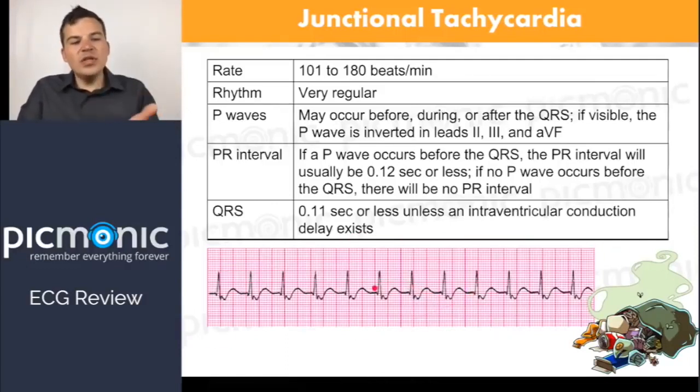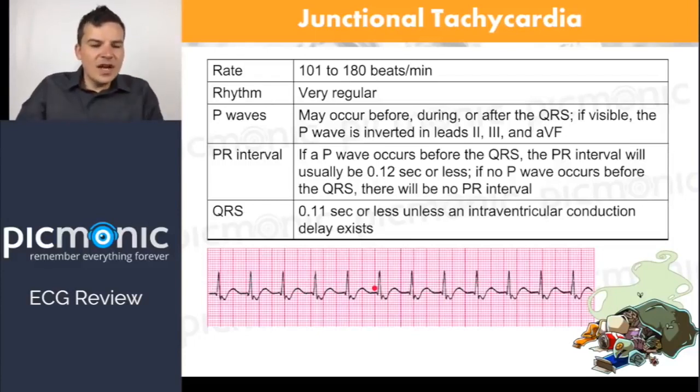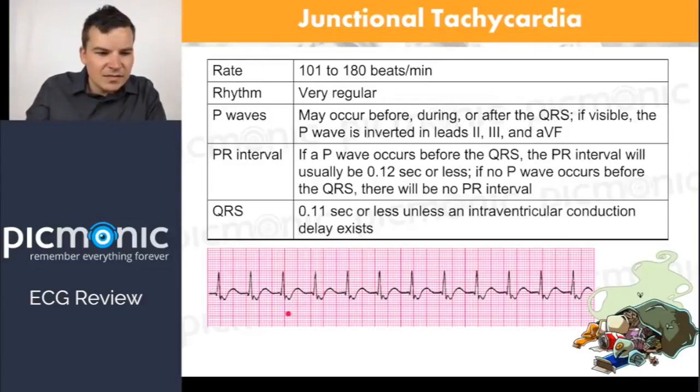So tachycardia. Then when we look at the rhythm, I'm just going to tell you right now, if you didn't already look, it's beautiful. It's regular all the way across. The R to R's and the P to P. Well, the R to R's are great, right? So the R to R's are regular. And then you look at the next one. You look down and you say the P waves. Is there a P wave there before every QRS? No. There's no P wave. What's this? There's no P. That's not the P. That's over here.